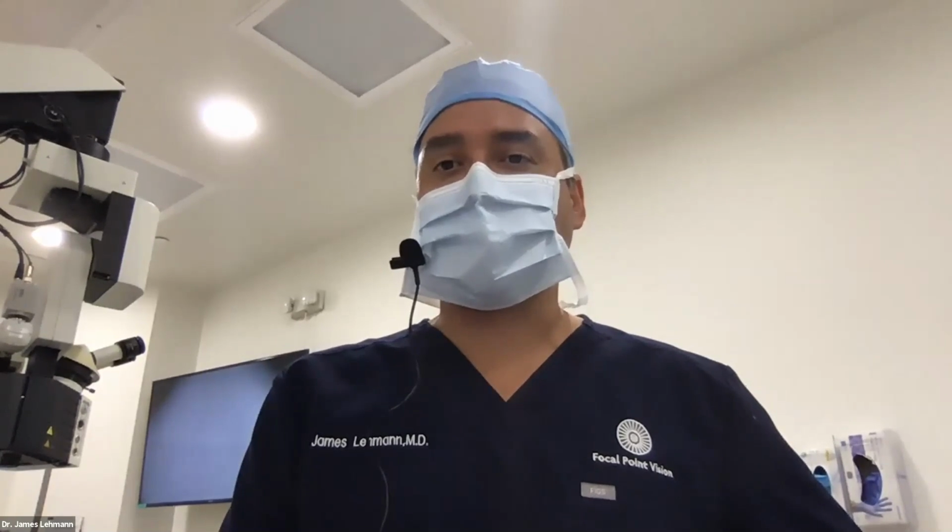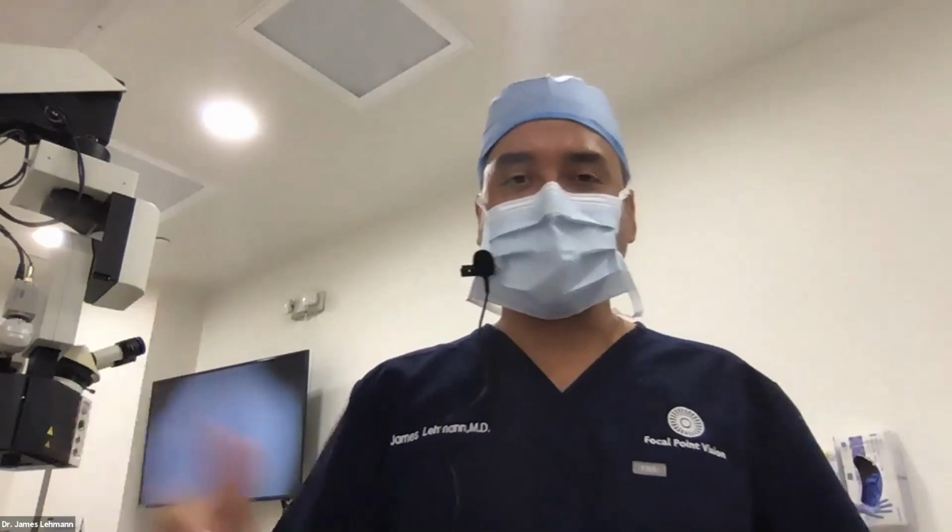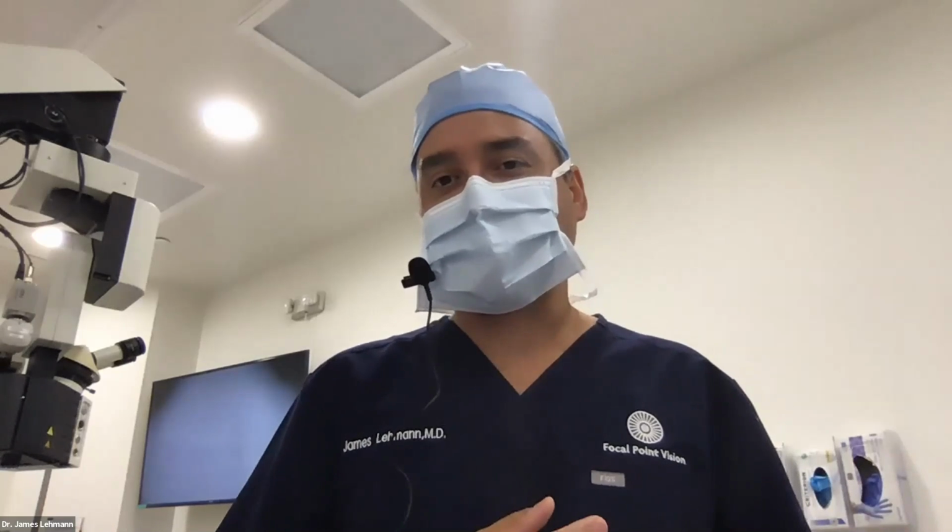Do I ever use bimanual technique for removal of cortex? I do not. Once in a while I will, but I don't like it because the chamber gets shallow and deep. You can't get enough inflow through that tiny little gizmo. So I never really liked it.